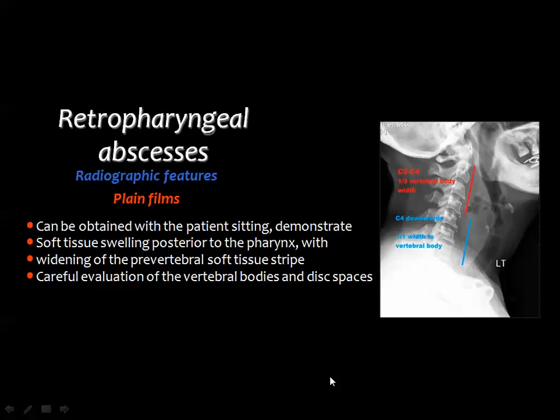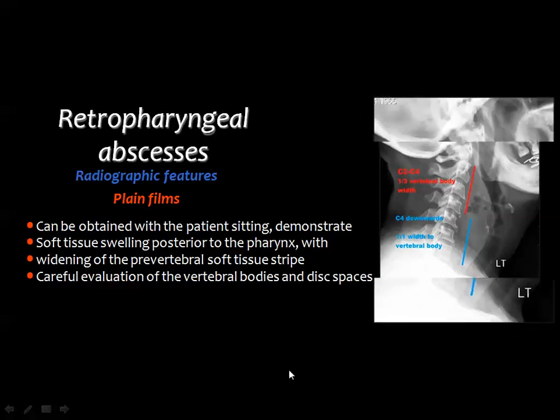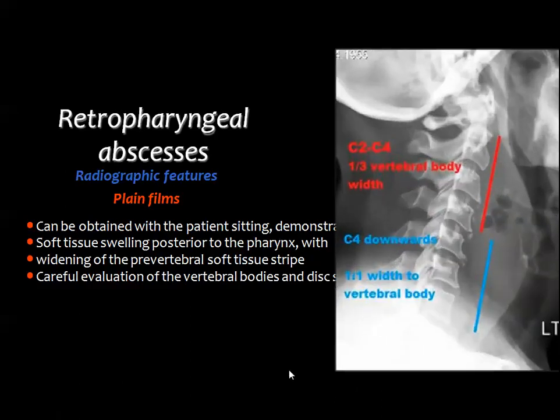And the retropharyngeal abscess is diagnosed, if it is large, by the plain X-ray of the cervical spine, the lateral view.